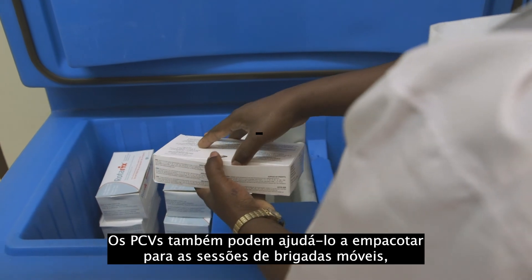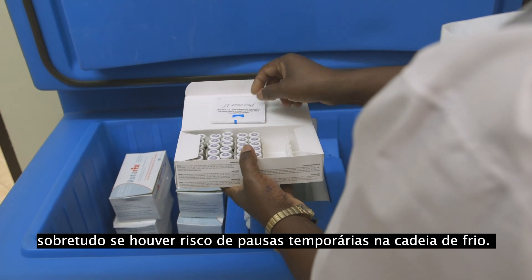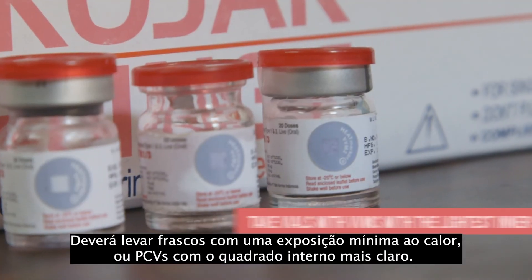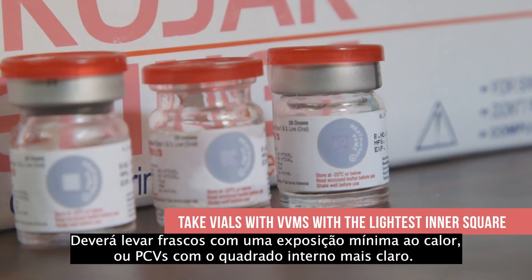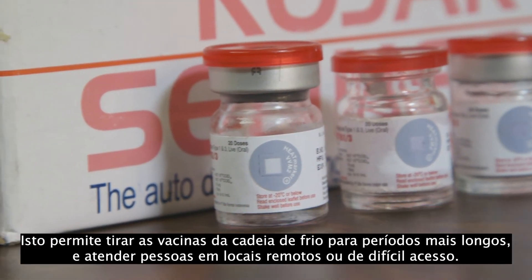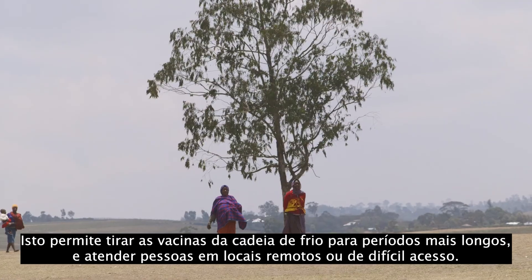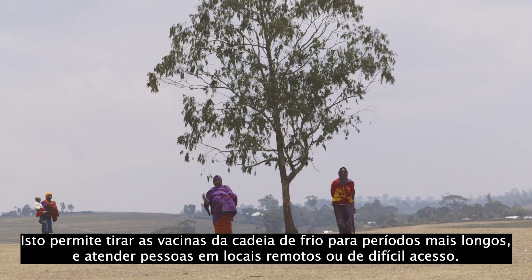VVMs can also help you pack for outreach sessions, especially if there is risk of temporary breaks in the cold chain. You will want to take vials with minimal heat exposure, or VVMs with the lightest inner square. This enables you to take vaccines out of the cold chain for longer periods and serve people in remote or hard-to-reach locations.